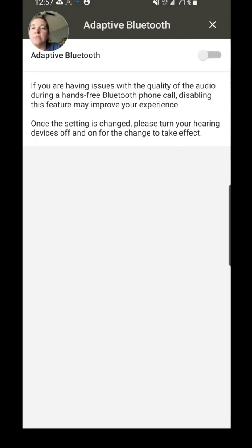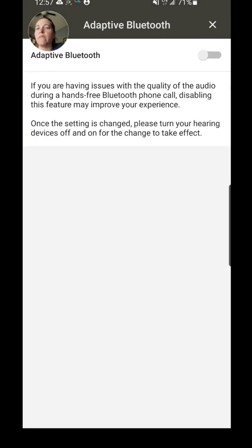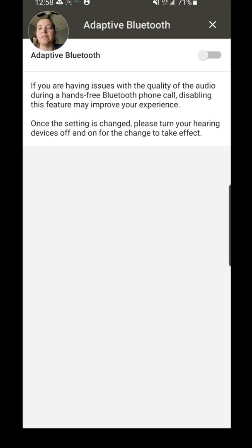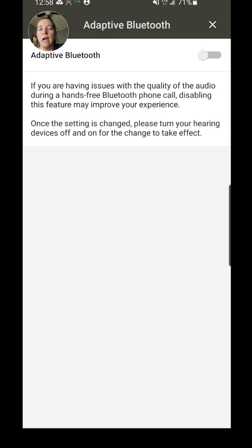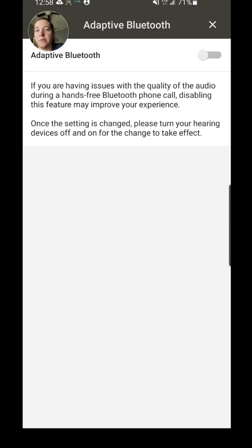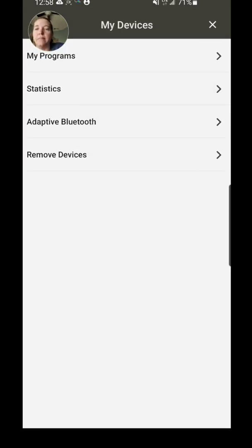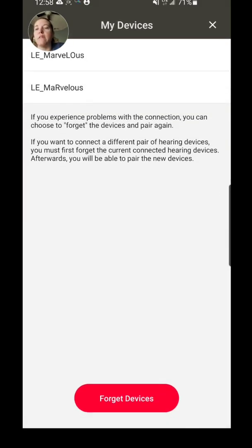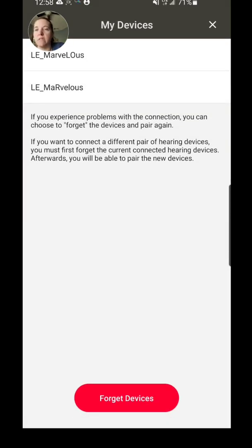If I want to go to Adaptive Bluetooth, this is something that is more for troubleshooting. So if you have some—like when you're making phone calls and people are saying 'I'm having a really hard time understanding you'—you can try turning Adaptive Bluetooth on. I haven't had any issues so I've just been leaving it off, but that's an option there that you can select if you need to.